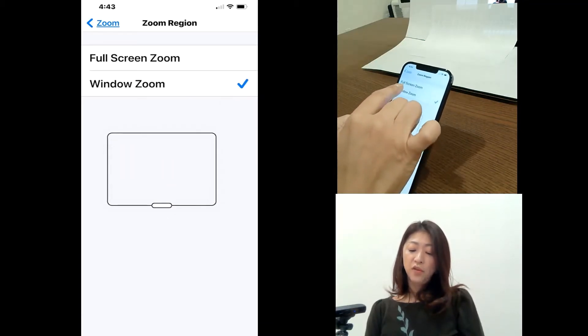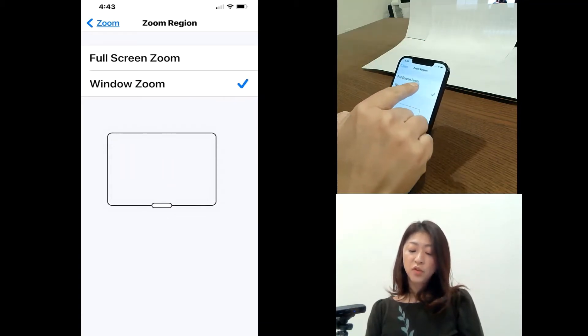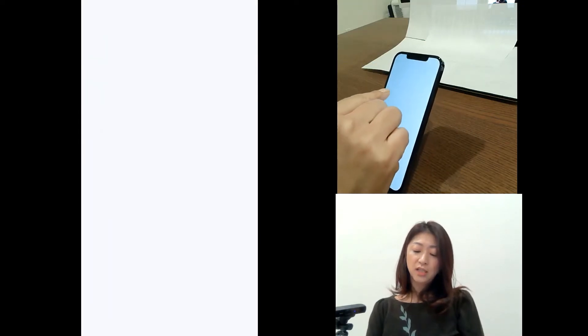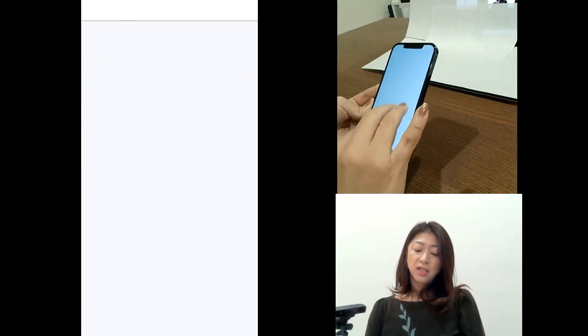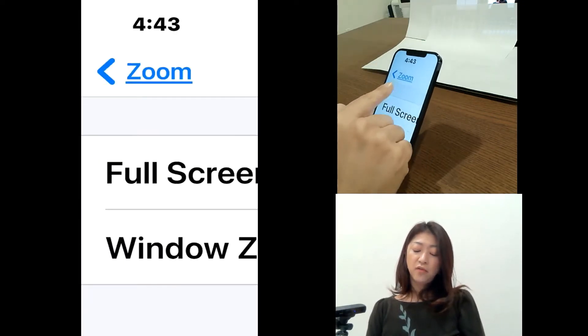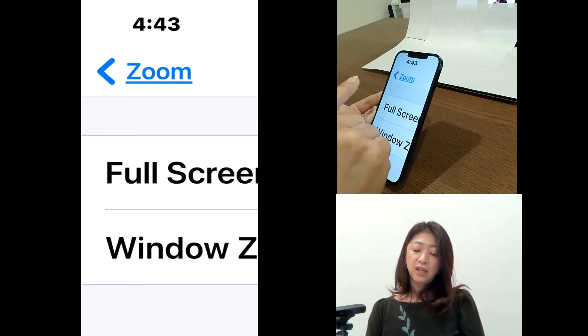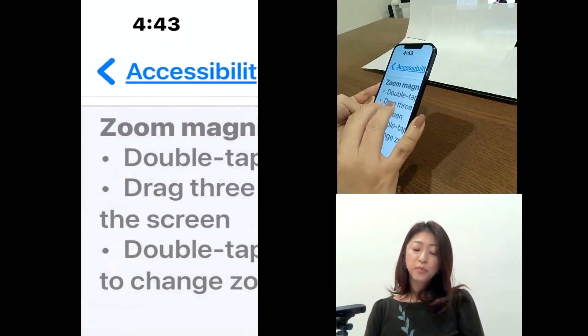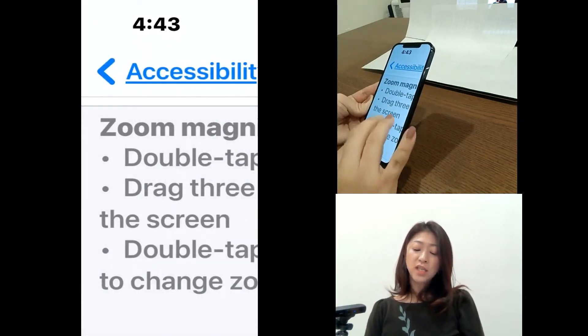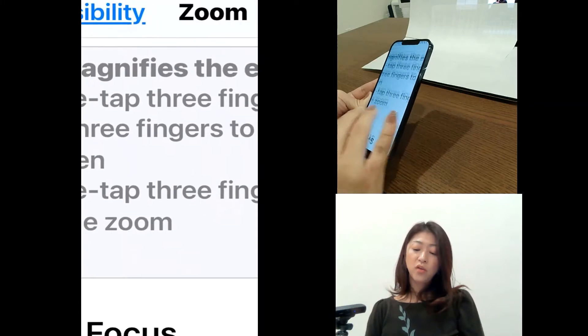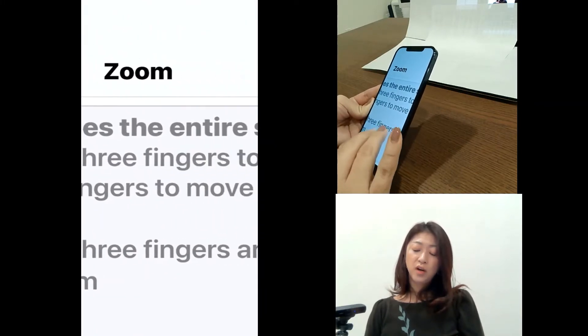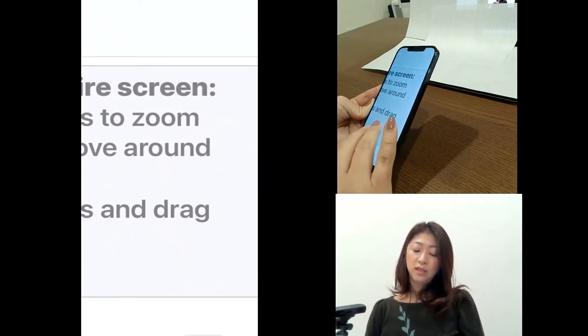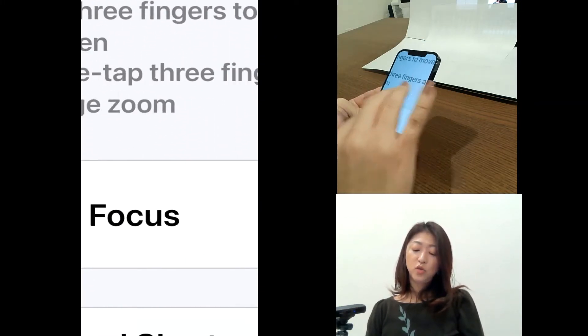But if you have a full screen zoom checked, then instead of getting that zoom window, you will see the whole screen of your phone is zoomed.